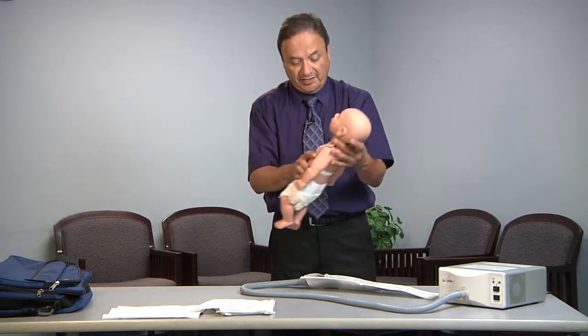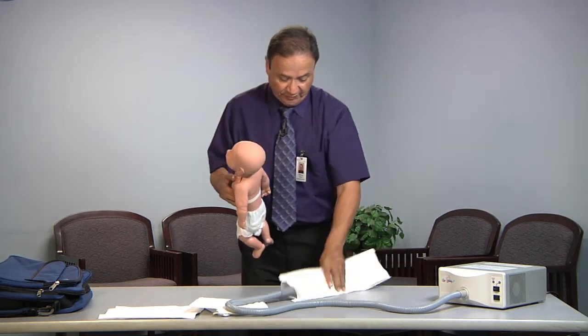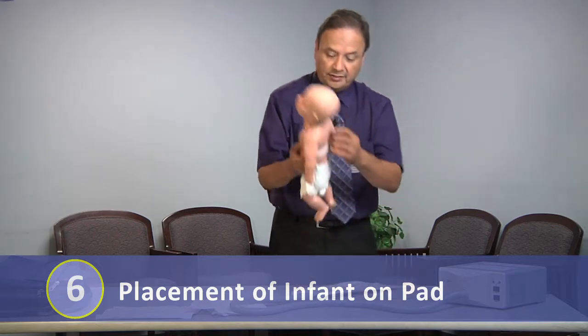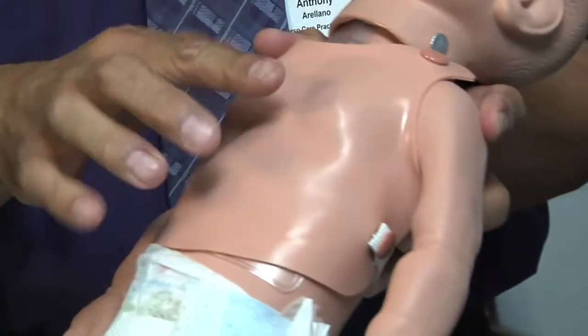Next thing to do is when we put it on the baby, we're going to lay the child. And like I said, it's a wraparound, so it may be a little difficult, but we're basically going to lay the child right under here. And remember, no chafing in this area, so you don't want to go too high, and be careful around the nipple line.